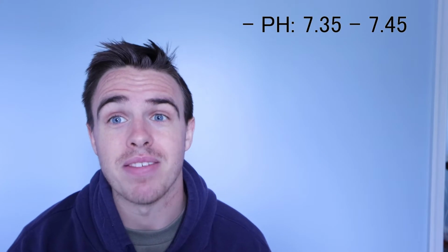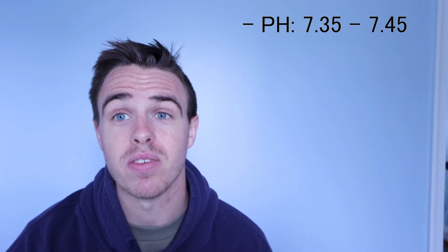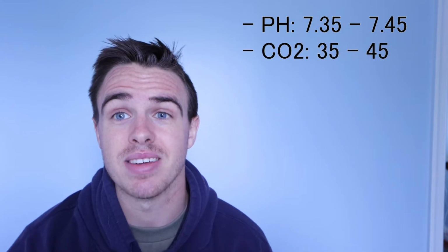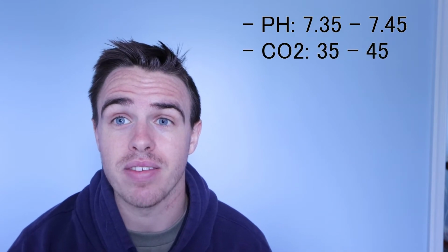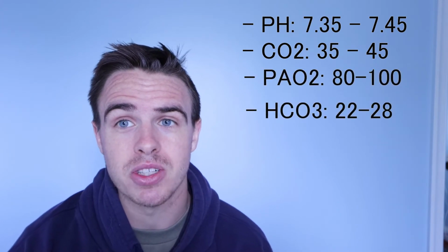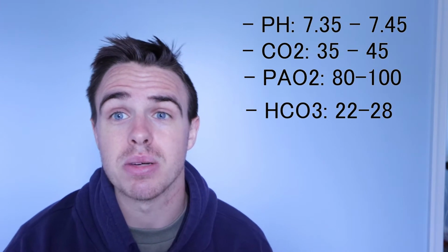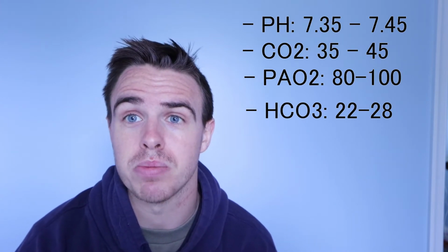So let's look at pH first. The normal pH is 7.35 to 7.45. For the CO2 level, it's 35 to 45. You look at the oxygen, it should be anywhere from 80 to 100. Now it can be above 100 and it can be below 80. So this is the pressure of oxygen within your body.